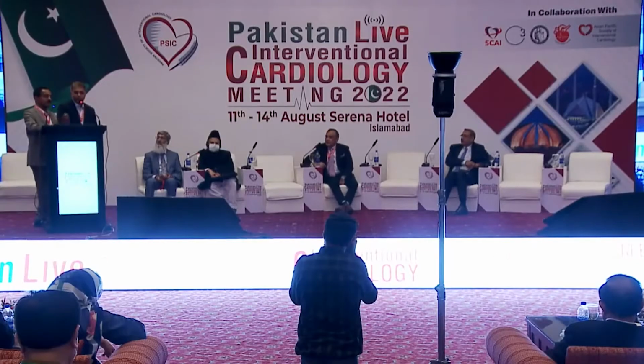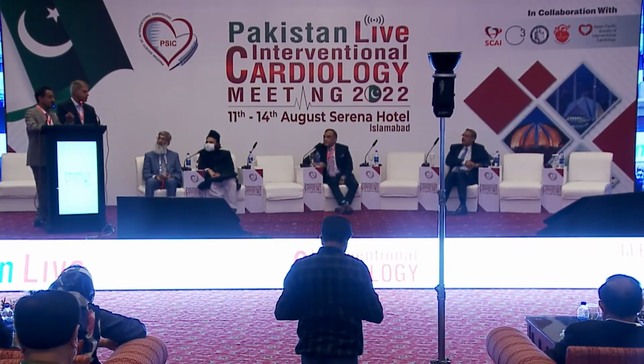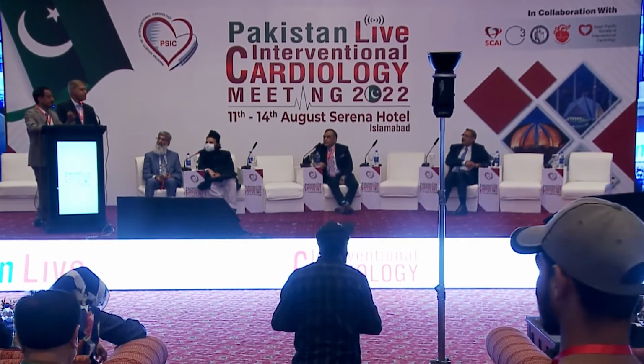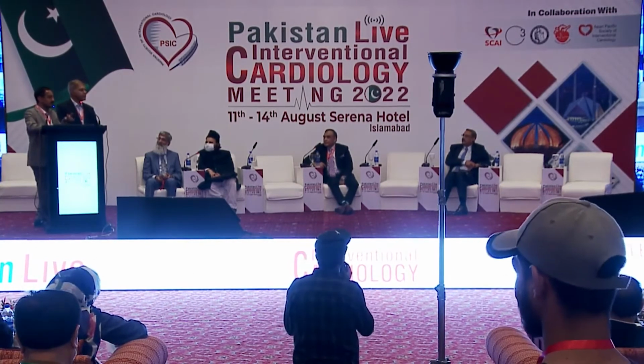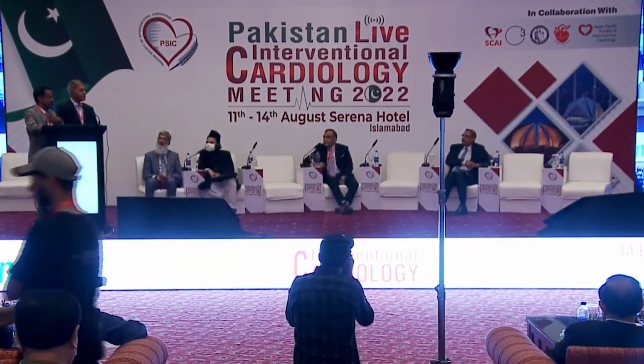There is a lot of debate about it. If there is some disease, and you balloon, I know you are saying just put a nose cone there, but if it is a little bit more, you are causing a balloon angioplasty, which may end up resulting in restenosis. There is no study which has shown whether opening the side branch or not makes much difference.